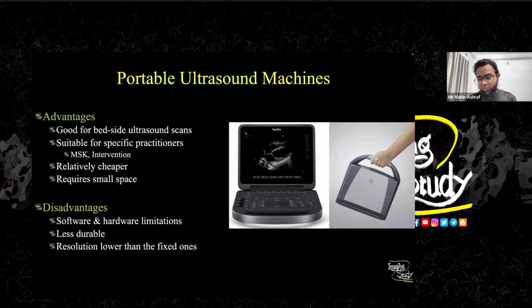Now, when I do ultrasound, I try to change the transducer very frequently. So with a single transducer, the scan is not satisfactory for me. So I need multiple ultrasound transducers. So this situation is not suitable for the portable ones. Now, there are some software limitations also.